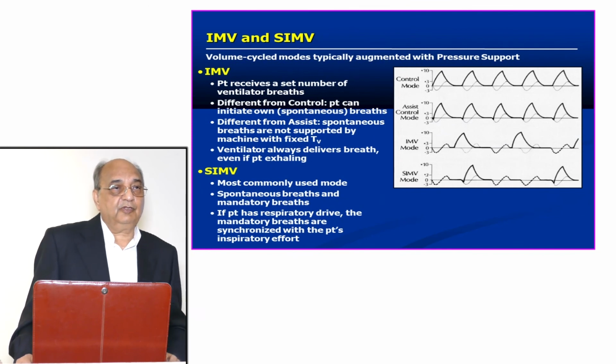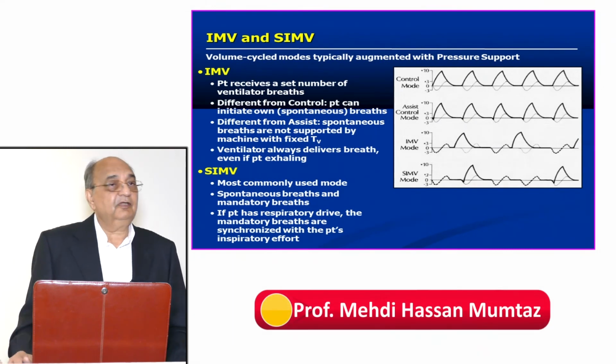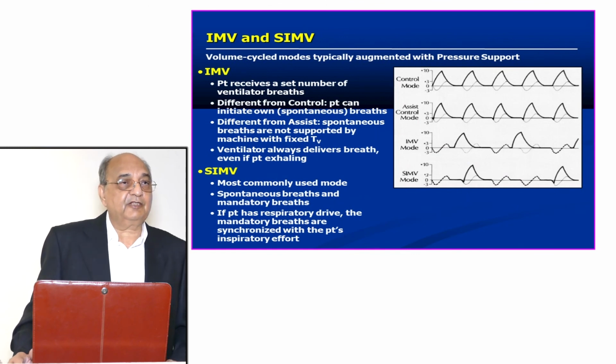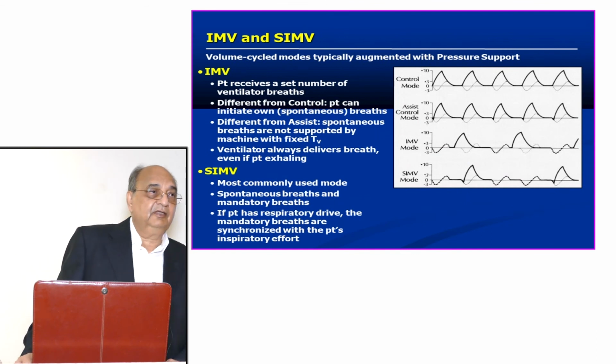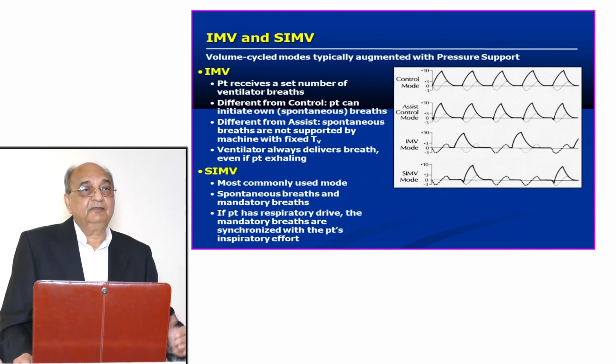So recruitment happens. So then we have to put the patient on BiPAP. After SIMV, we put on BiPAP. After the BiPAP, we put on a T-piece circuit, and then we see if there is an indication to extubate the patient or not. We look at the indication for extubation.